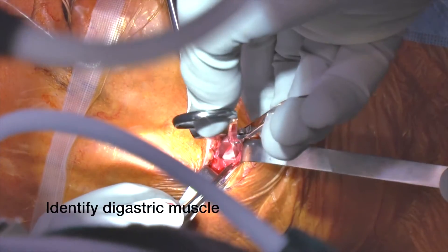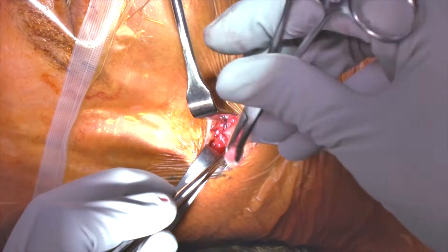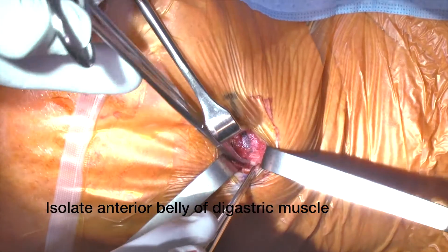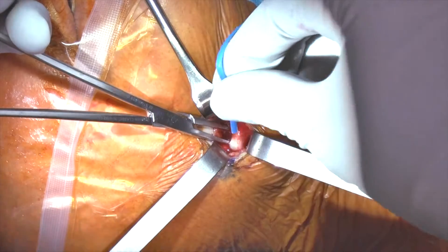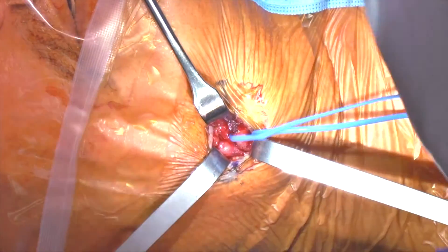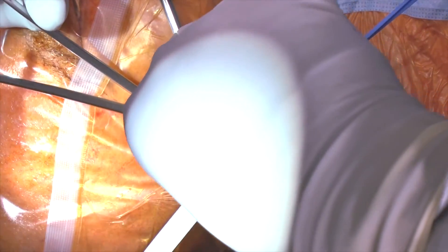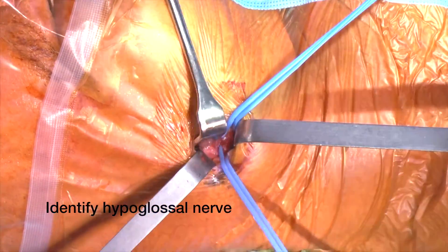And then we identify the tendon of the digastric muscle. That dissection is typically pretty straightforward, especially if you're able to palpate the hyoid bone, which typically leads us right to the tendon. Once we have the tendon isolated, we place a right angle clamp underneath the tendon and secure two blue vessel loops to the tendon to help with retraction — one more anteriorly and one more posteriorly. Our goal is to not disarticulate the tendon from the hyoid bone, but to just make two small tunnels and use them to retract inferiorly with the blue vessel loops.